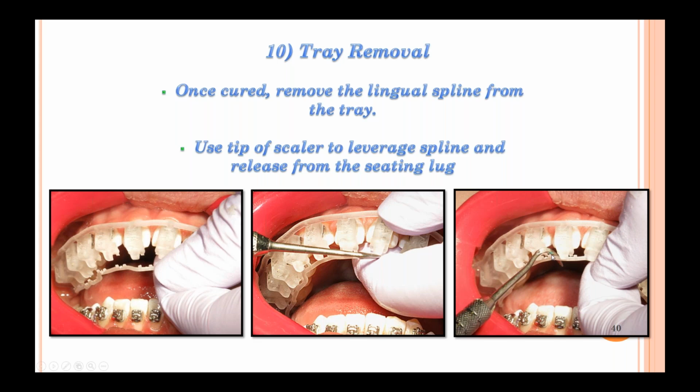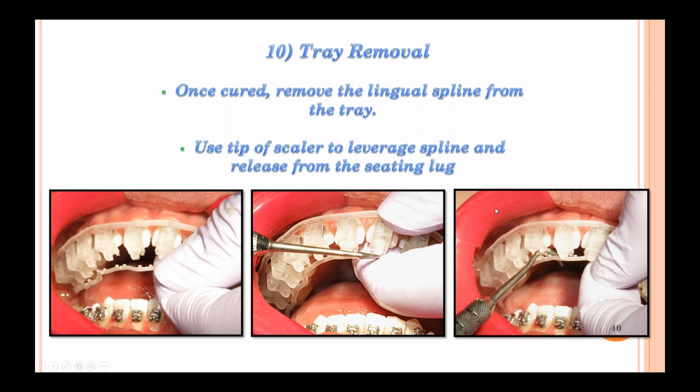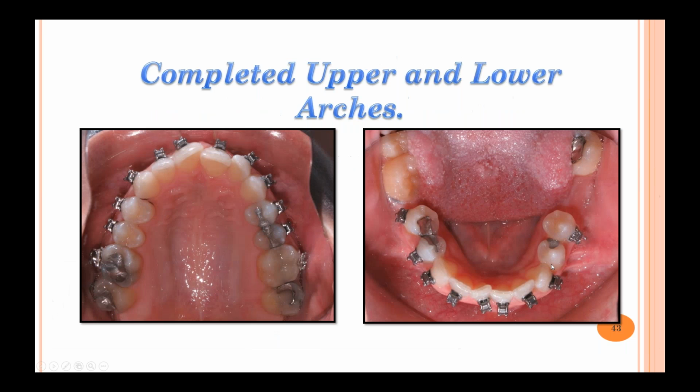And then we take the scaler to basically peel, and I think we've got another slide right here. Yeah. No, actually we don't. We take the scaler and we just peel right there from the gingival and just peel it right off. Here is an example of a segmented tray. I'm sorry, I just put this in just prior to the webinar, but just to show you how one segmented here because of the rotation, and then we've got another one here as well. And obviously with the maxillary, we were able to do it all full segmented. But here's the scaler removing the indirect bonding tray by going from gingival to occlusal.